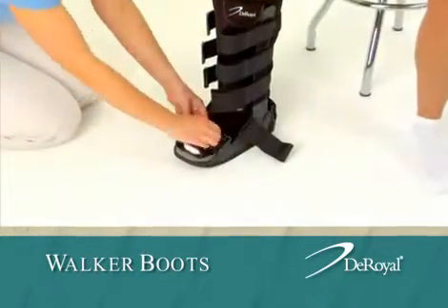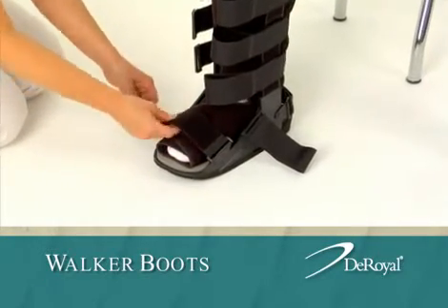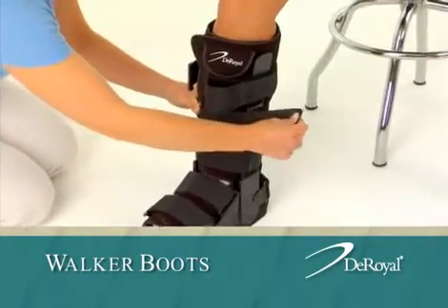Beginning at the bottom, pull straps through the D-rings and secure with Velcro. Work your way up the leg, securing each strap.